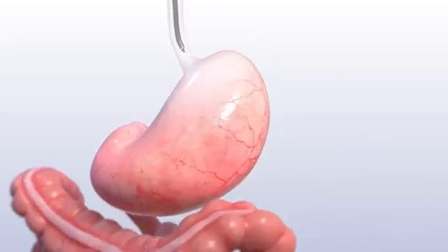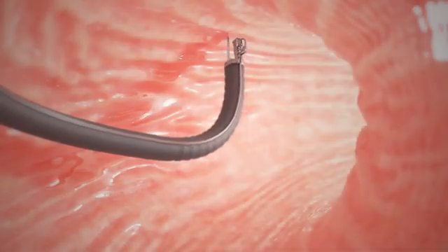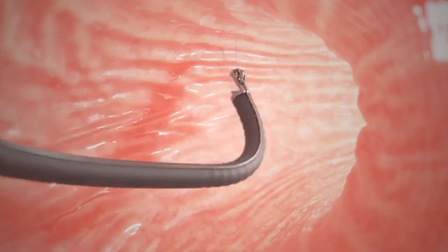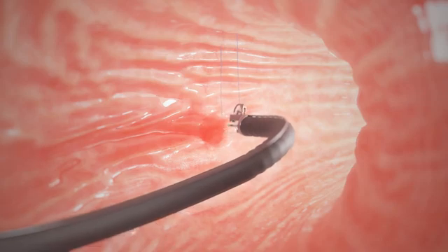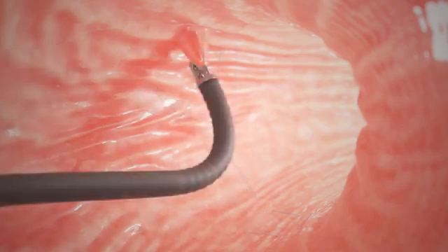A specially trained doctor passes the device and camera through your mouth and into your stomach. The doctor uses the suturing device along the large curve of your stomach to sew it into a smaller shape. The stitches or sutures are placed in a U-shaped pattern starting near the bottom of your stomach and working towards the top of the stomach.